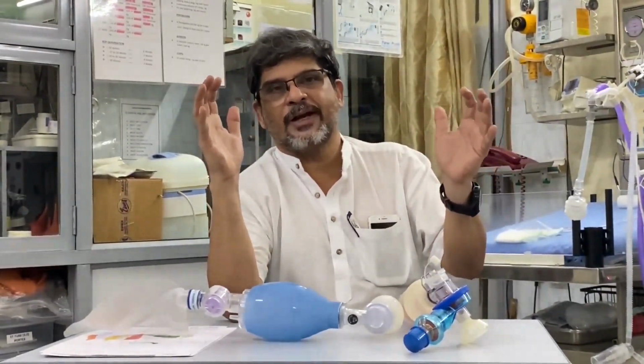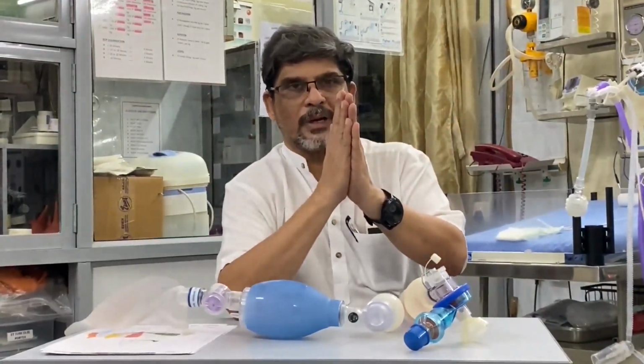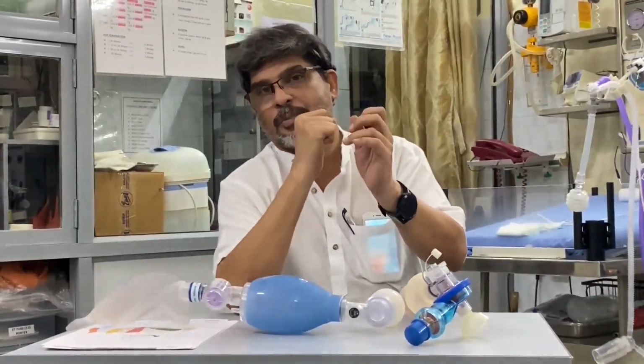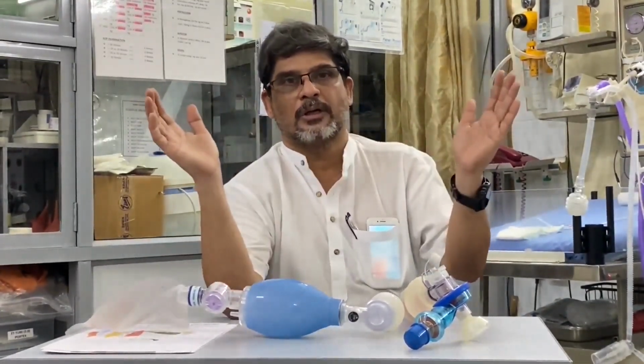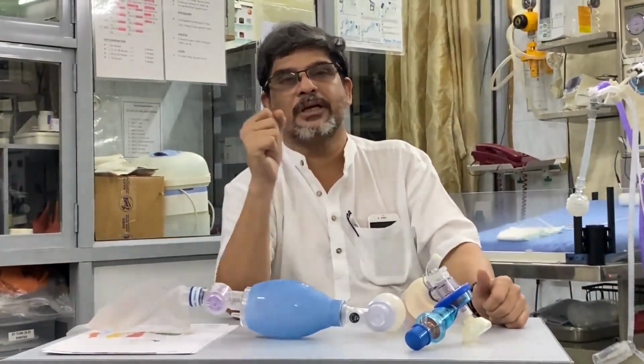Now imagine you allow the inflated balloon to deflate totally to zero pressure. With the next breath you again have to put in the same amount of exertion to inflate it. So each time you allow the lung to collapse totally and try to expand it, you generate a lot of pressure and your work of breathing increases.